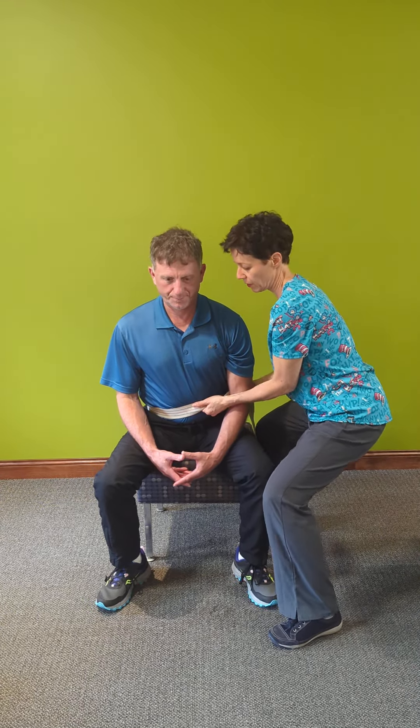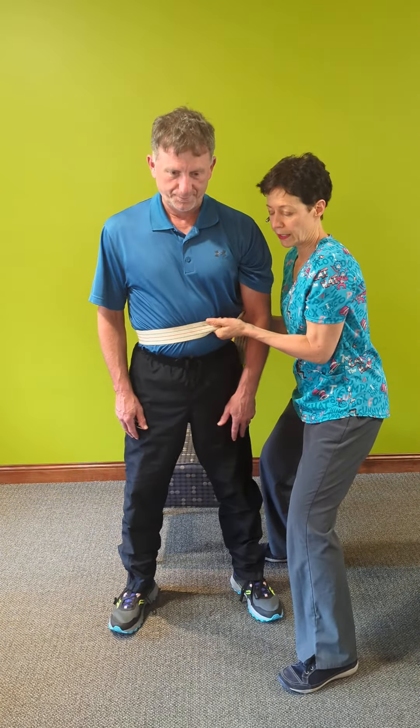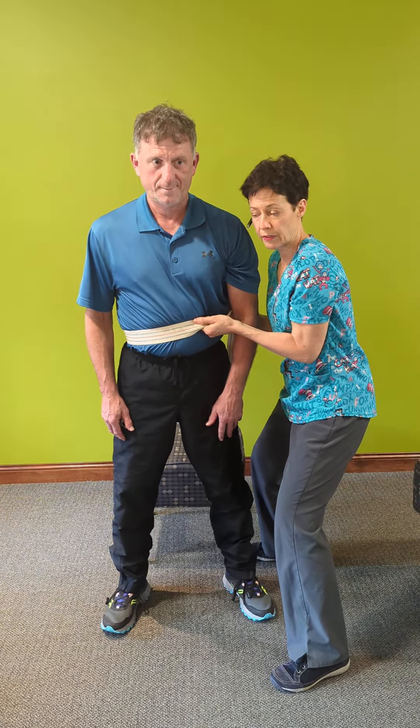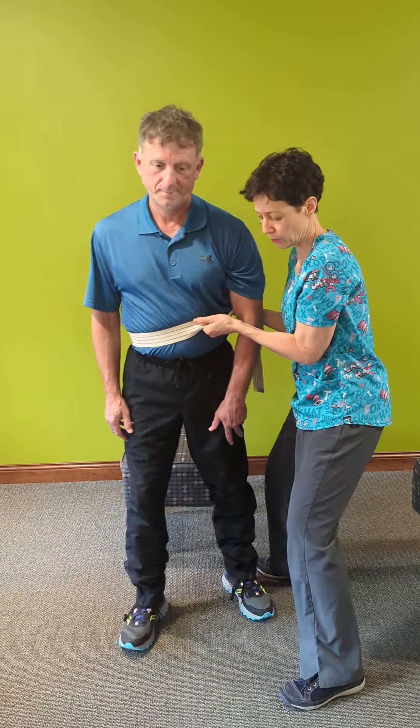On the count of three, go ahead and stand up. I'm really close to Steve right now, and when I transfer him, I'm going to crab walk with him, which gives me a lot of safe control. Not very pretty, but it's very safe. Go ahead, take a couple of steps.